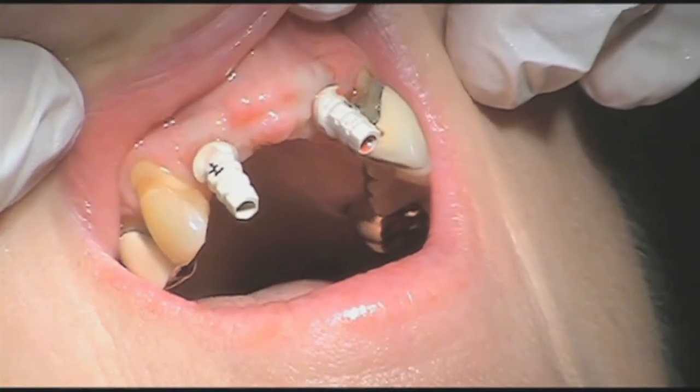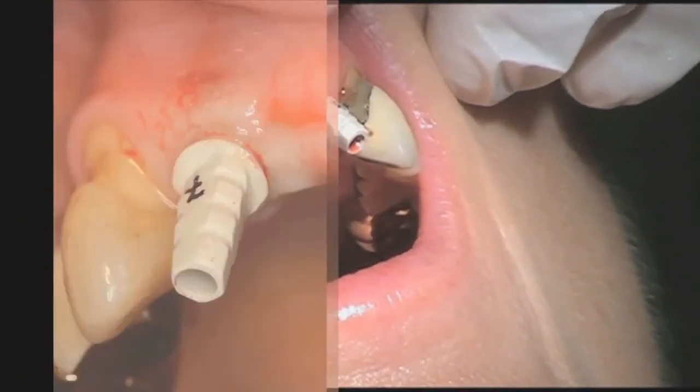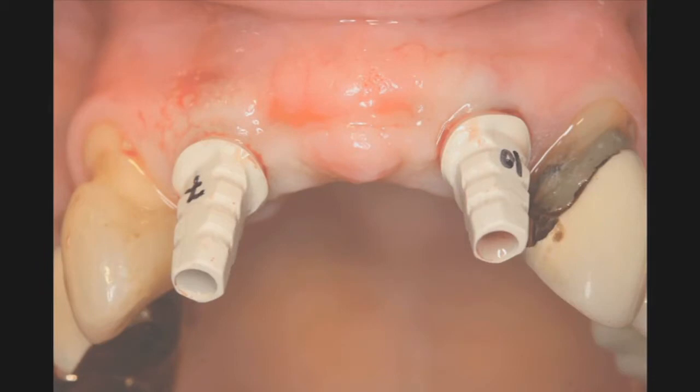This material is soft enough that if we do decide to take our impressions following integration after 4 or 5 months of healing, we could prepare this abutment, and the laboratory would then have something very ideal to start making the final aesthetic prosthesis.